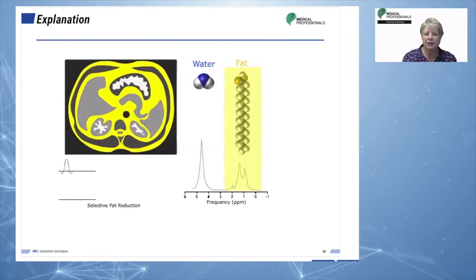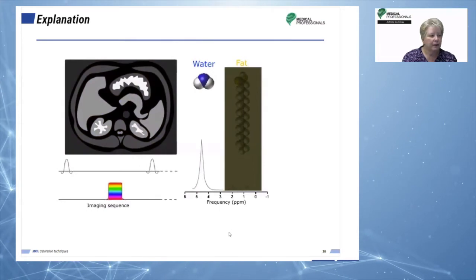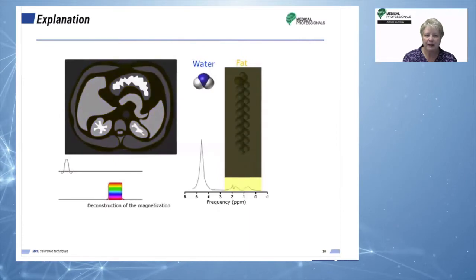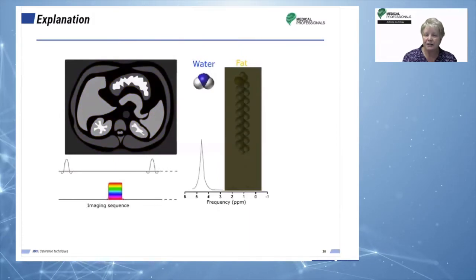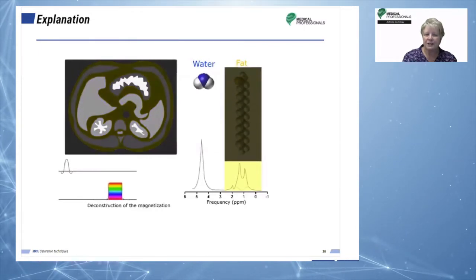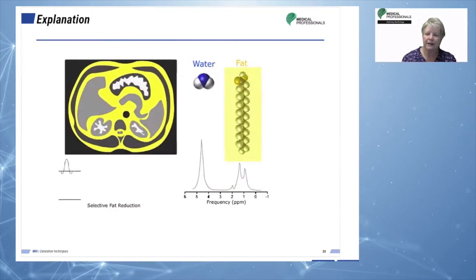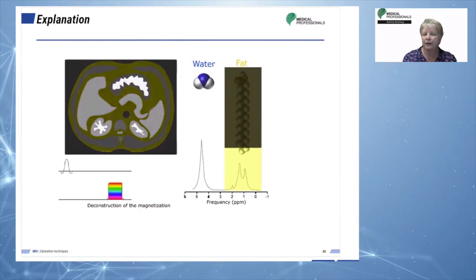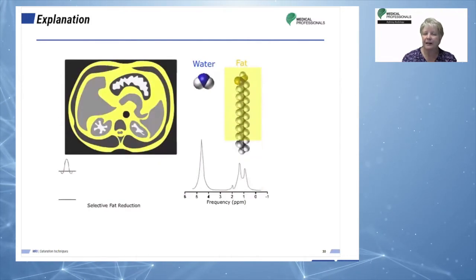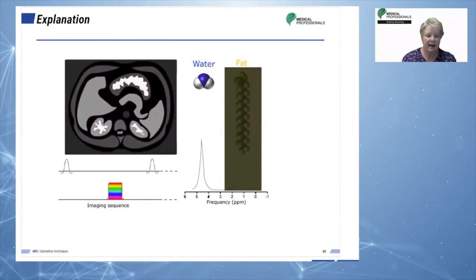In this animation, we can watch the process through the pulse sequence. Notice the saturation over just the fat peak. Also notice the changes in the animated image. This is the fat saturation technique used when the operator selects fat saturation, or FS, in a standard protocol. Theoretically, all that needs to be done is to click the option that says fat sat.